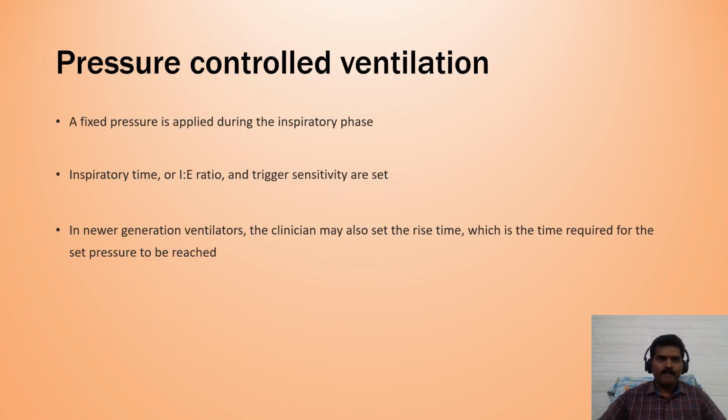Pressure control ventilation. A fixed pressure is applied during the inspiratory phase. Inspiratory time, IE ratio, and trigger sensitivity are set by the clinician. In newer generation ventilators, the clinician may also set the rise time, which is the time required for the set pressure to be reached.